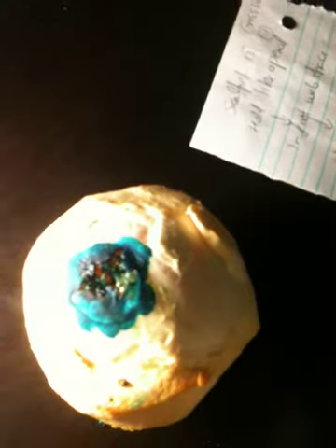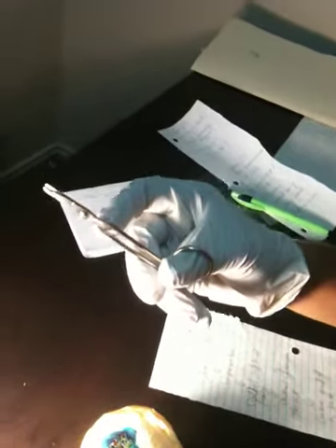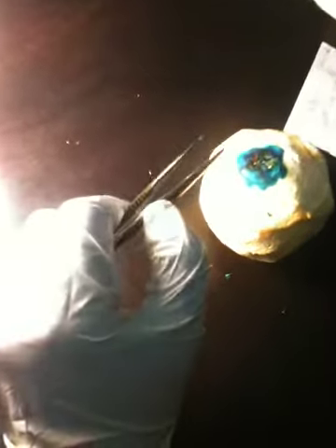The key thing here is that the scissors would remain in the dominant hand, which is the right hand in my case, held like this between the first and the fourth finger, and for reinforcement you'll use the index finger, and the scalpel would remain in the first web space, with the forearms placed on the table.